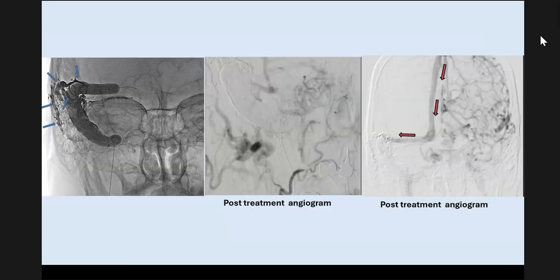Again, this patient underwent embolization, a large balloon was put in, and these fistulae were occluded by embolizing material. And this is the post-treatment angiogram. You can see the balloon still there and the cast of the embolic material used. There is no abnormal filling of the venous sinuses, which we saw earlier, and the normal flow has now been restored. So the superior sagittal sinus fills up first, as expected, then the transverse sinus, and eventually the sigmoid sinus, while the sigmoid sinus is still occluded, I think, with the balloon.